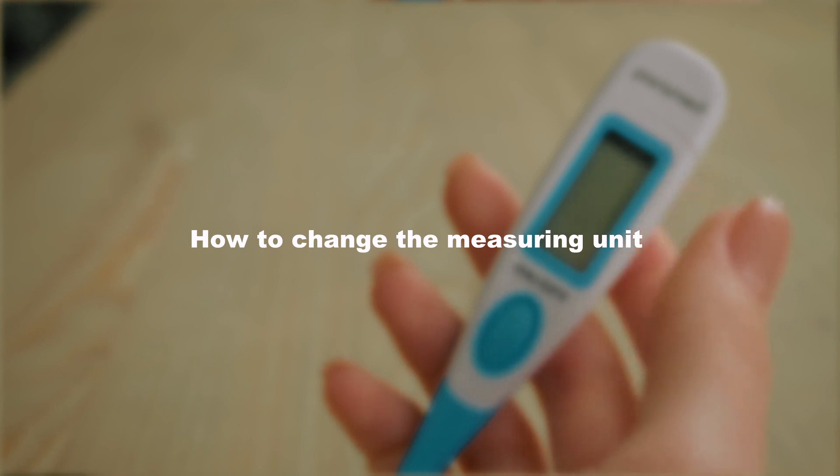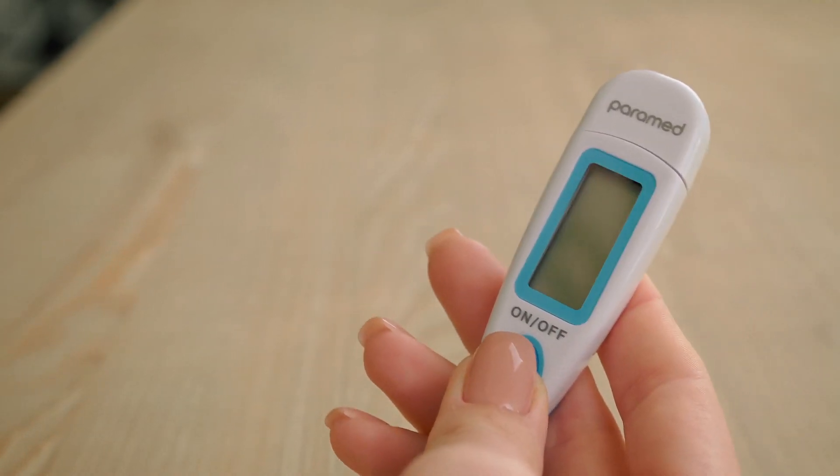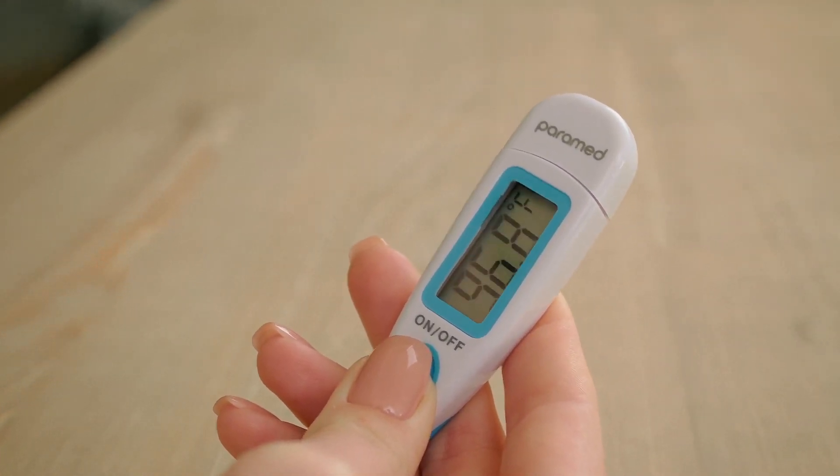How to change the measuring unit? To change the measuring units from Celsius to Fahrenheit, you need to press and hold the on-off button for 4 seconds. To return to Celsius, repeat the action.